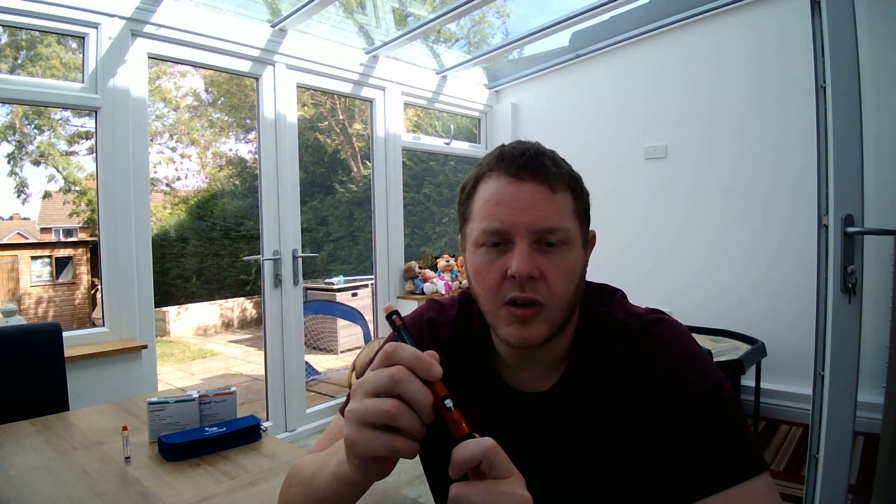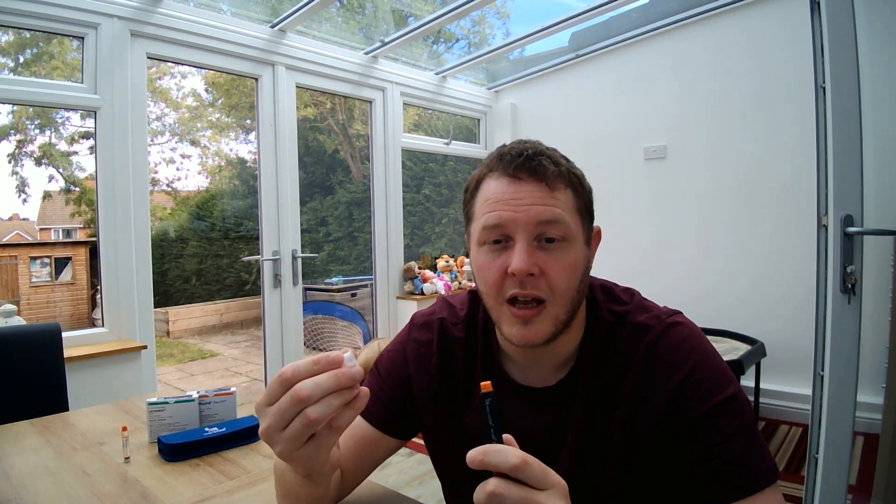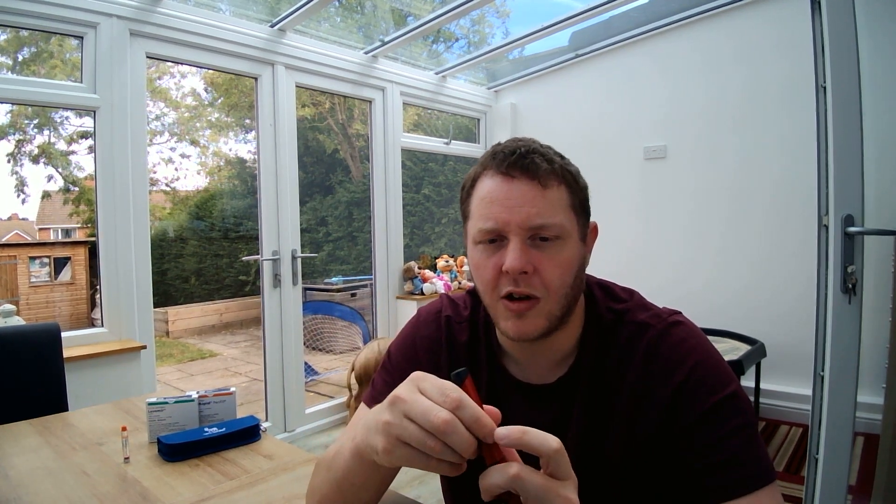Once you've done your air shot, you can then calculate how many units you need to take with your meal, or for your long-acting. Dial up on the smart pen, choose your injection site, then use the dose memory by pressing the button and injecting for your recommended time. Once you've injected, get your outer needle cap, place it onto the needle, twist until it comes off, and dispose of it in your sharps box. Then get your pen cap back on and you're ready for your next injection.